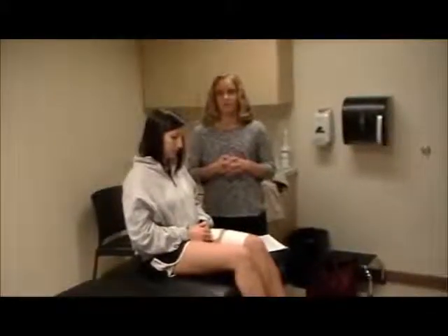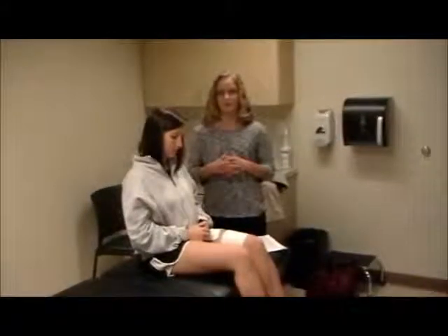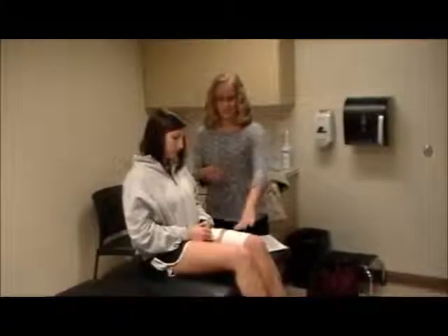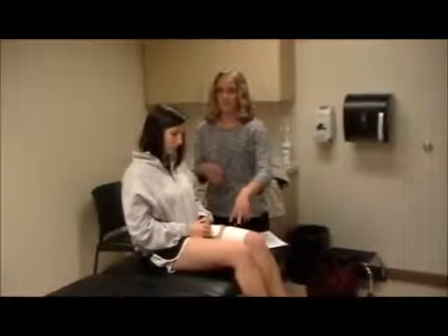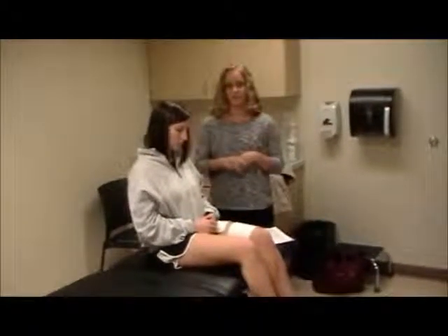They prescribed an unsupervised home exercise program — a 60-minute protocol with one 5-minute rest break. They used large hydrogel electrodes placed on the proximal and distal hamstrings and quads on both sides. I just have her set up on one side to show you.